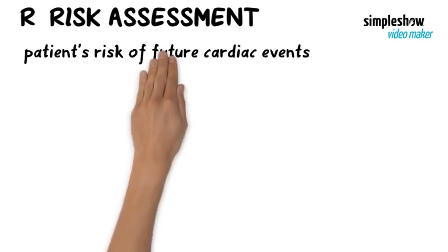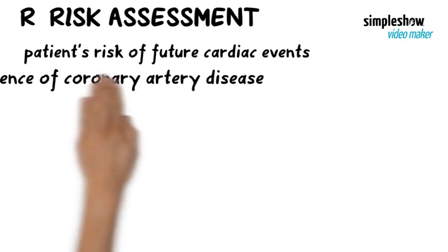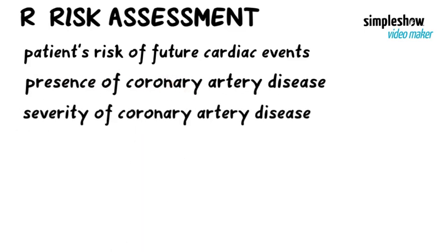R. Risk assessment. The stress test helps assess the patient's risk of future cardiac events by evaluating their heart's response to exercise or stress. It can provide valuable information about the presence and severity of coronary artery disease.